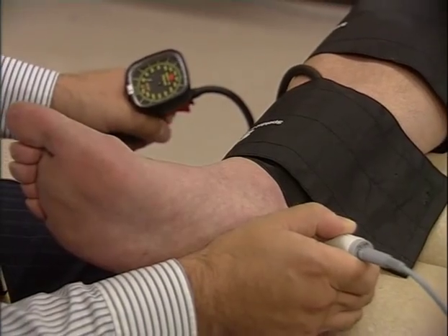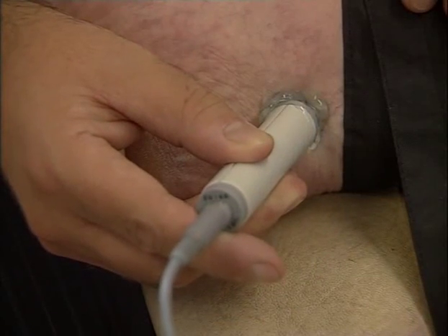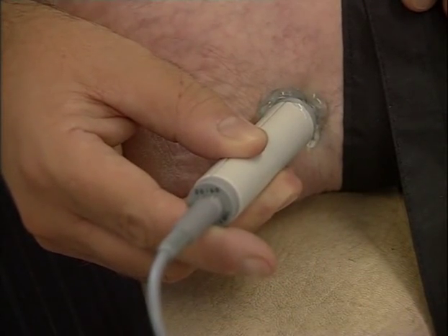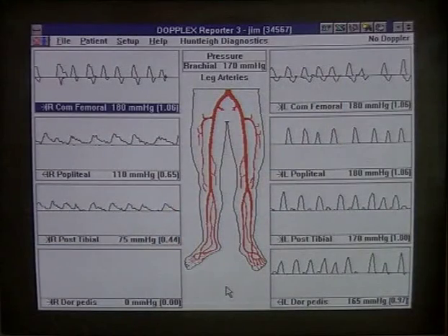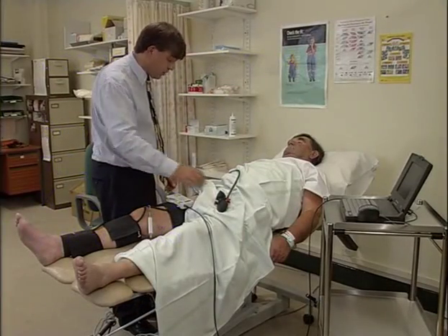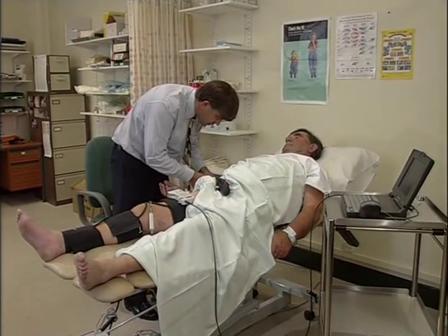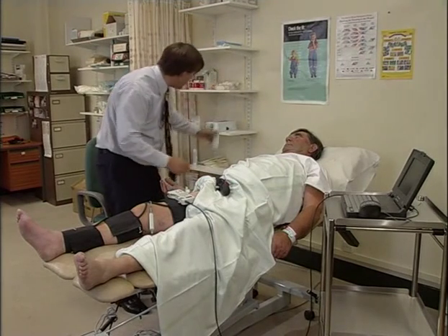The pressure recorded corresponds to the position of the cuff. The probe is at the posterior tibial artery, as the dorsalis pedis signal is too weak to record. For this patient, the pressures were brachial 170, thigh 180, below the knee 110, and ankle 75. In general, a pressure drop of more than 30 millimeters of mercury indicates a stenosis within that segment. Both the pressures and waveforms suggest superficial femoral artery disease. An angiogram of this patient's legs confirms a 10 centimeter occlusion in the superficial femoral artery, which has been successfully treated with angioplasty.